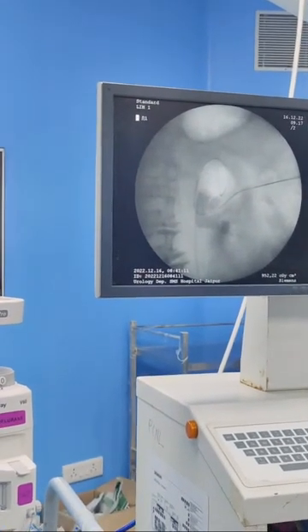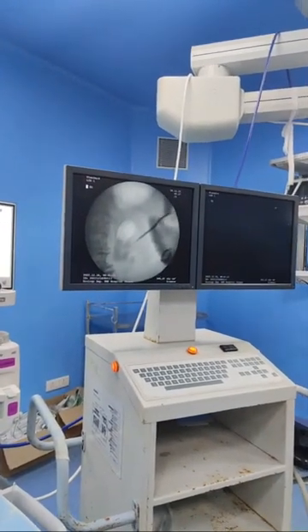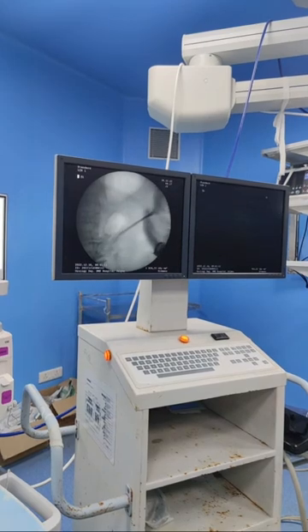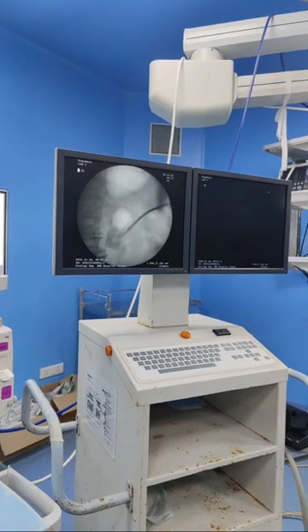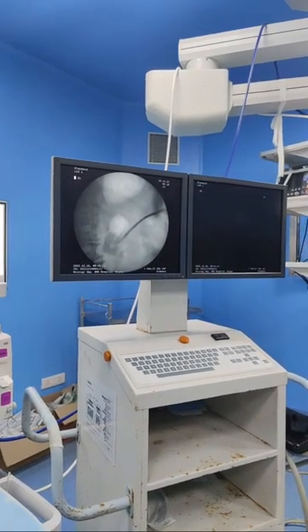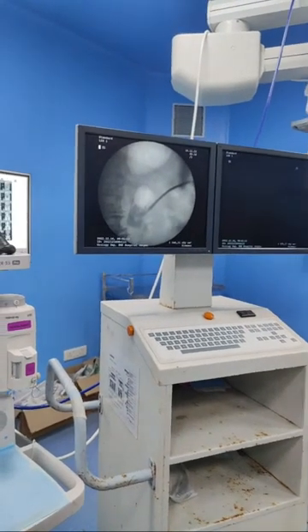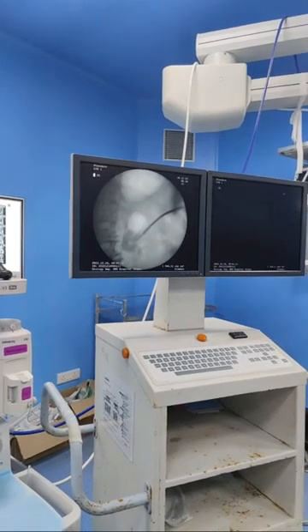We are dilating it with a screw dilator. This is a 10, okay, 12. You have to dilate in the direction of the track. And this is what precisely is happening. So we have reached the stone. All right. So what we plan to do is by 21, I think. So this stone may require maybe 2-3 more punctures. Let's see how much we can remove with this particular track.